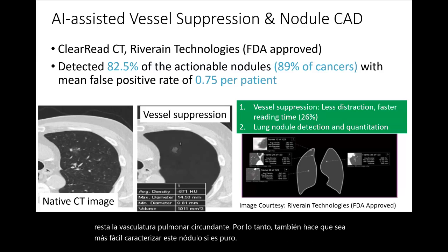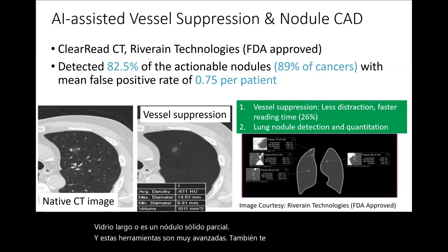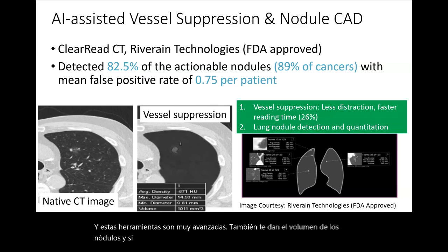And these tools are very advanced. They also give you the volume of the nodules, and if you compare them over sequential studies, it will also tell you the incremental growth, the change in the volume over a period of time.